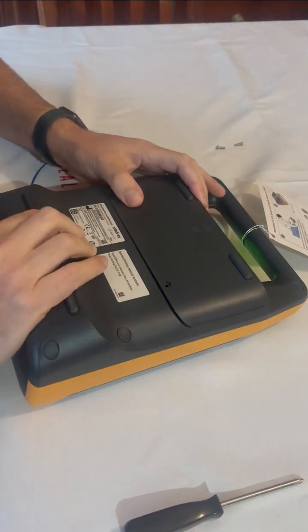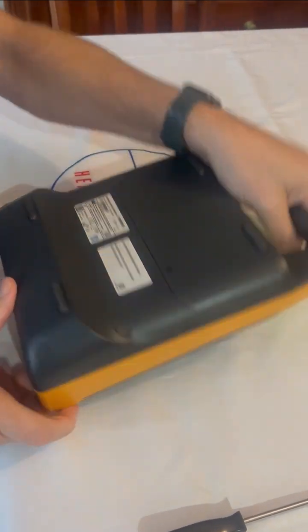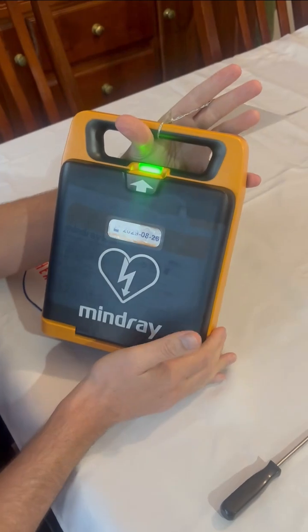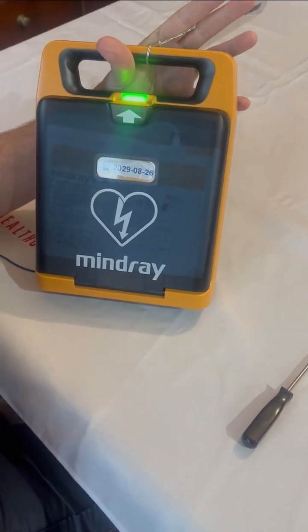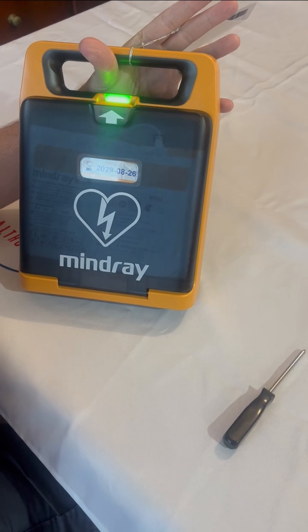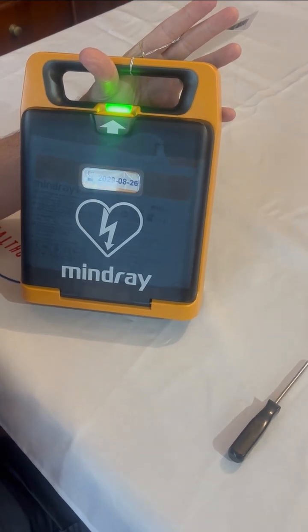Place the battery cover back in position, but do not tighten the screws yet. Once installed, the AED will automatically perform a self-test. Check the indicator light. It should display a green status, confirming the battery is correctly installed and ready for use.